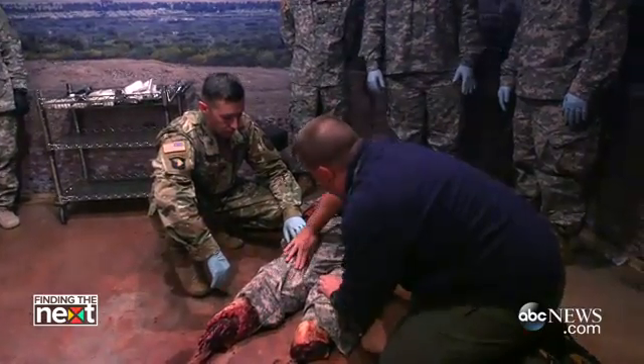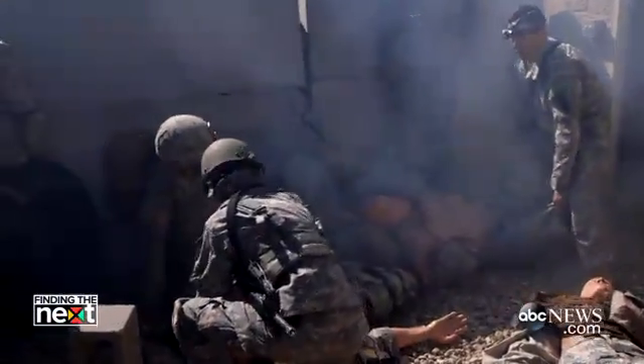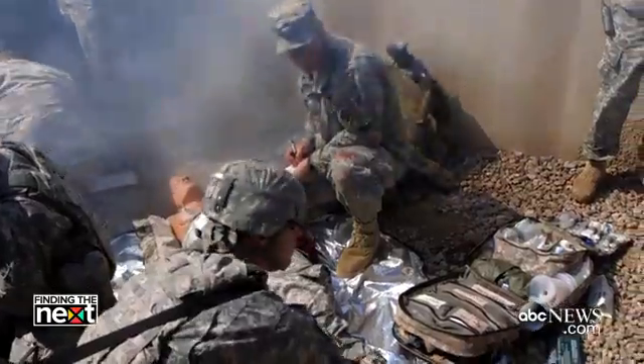Prior to these mannequins, we trained with just basic CPR mannequins with a little bit of red Kool-Aid on them. They had no internal mechanics — they were just a shell. We had to drill holes in the nose so that students could put NPAs in them. Training was nothing more than your NCO sitting down with you and going over a checklist. Everyone was really good at regurgitating the answers, but when it came time to apply it, it was a completely different story.